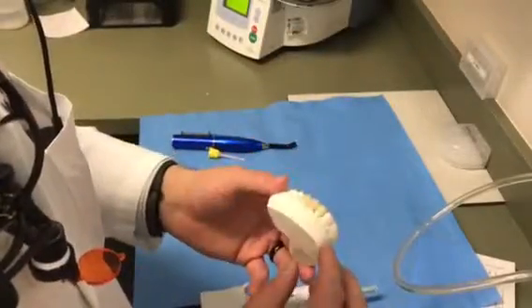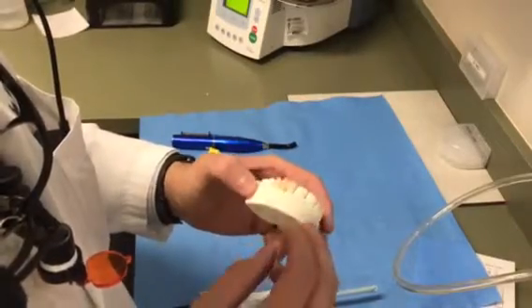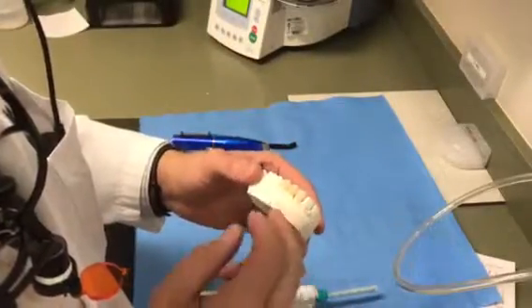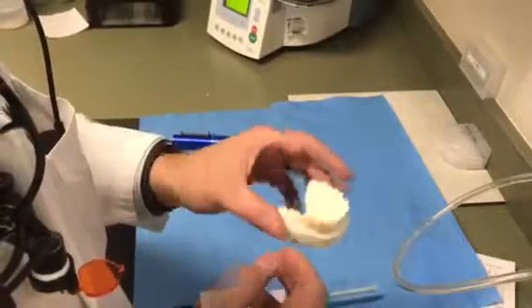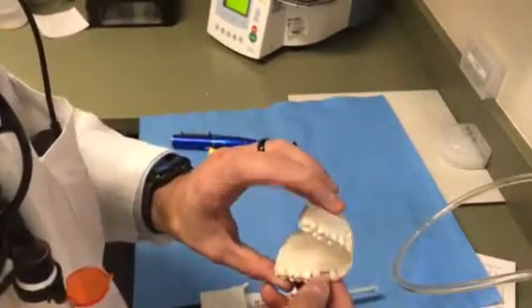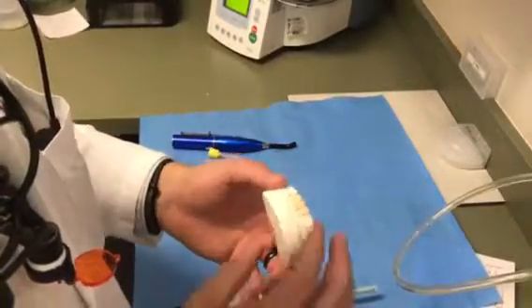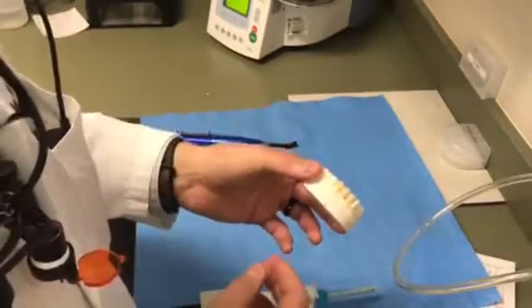There are like 4 or 5 different things you can send to the lab to communicate the space that they need to fill when you're sending a bridge or a crown back for open contacts, or just needing to recontour gingival embrasures or underneath the intaglio of the Pontic site. I wanted to cover those real quick because most of these, I don't know that I really learned in school. I just kind of figured it out as I went on.